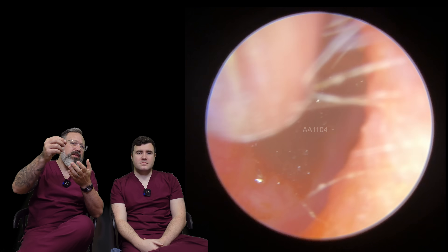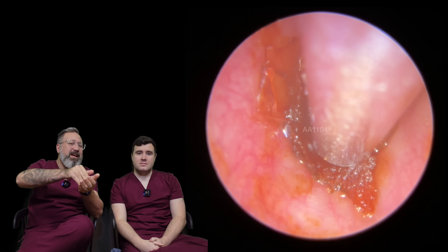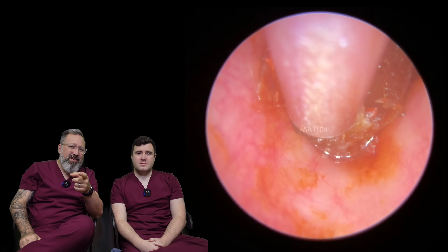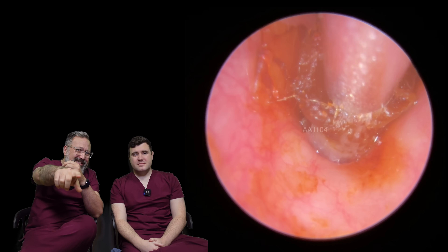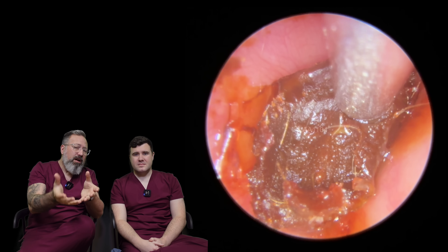The reason I didn't use that Jobson horn to take that off is I would have had to literally press against the canal wall. And don't forget, this is a pediatric patient — they've never had wax removed from the wall before, so they were a little bit nervous about anything. And when it is this deep, you're always conscious of the sensation. There's the dead skin — you could see as I lifted there was a tiny little bit of a flinch. So I can't lift up.